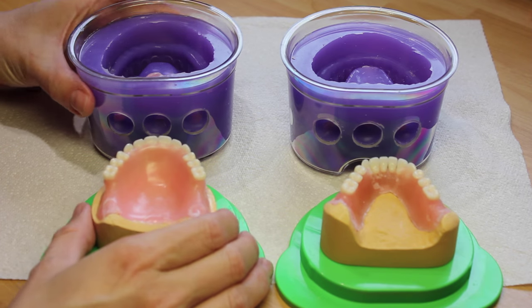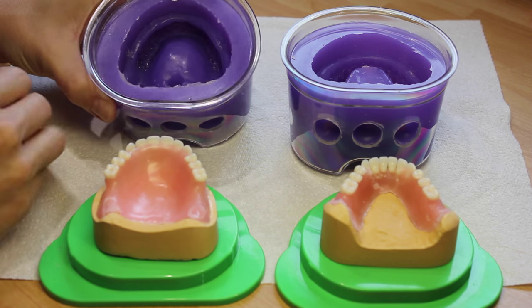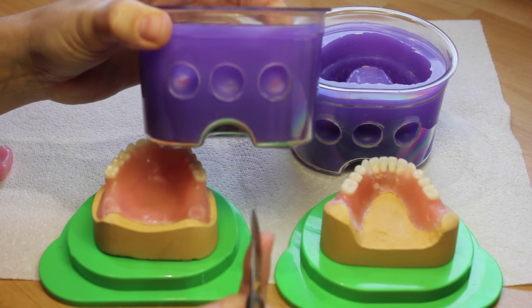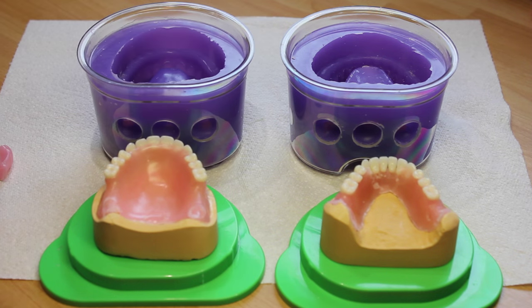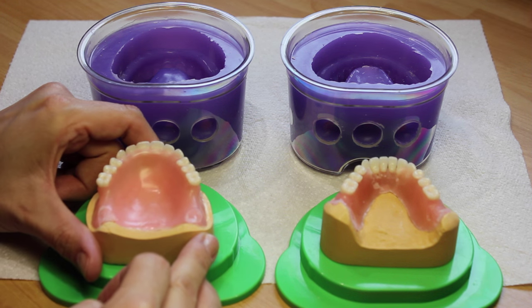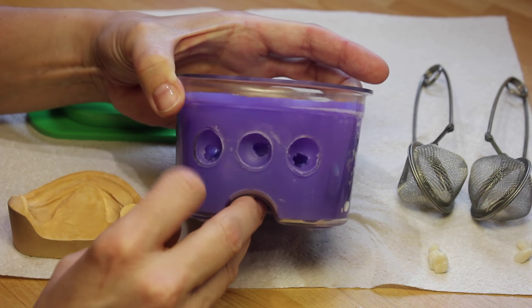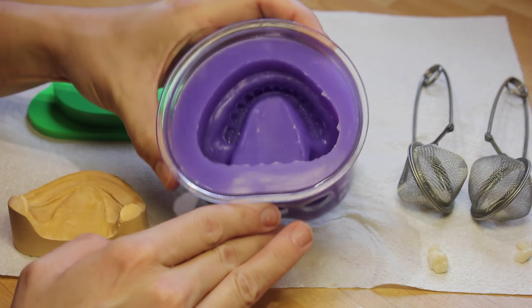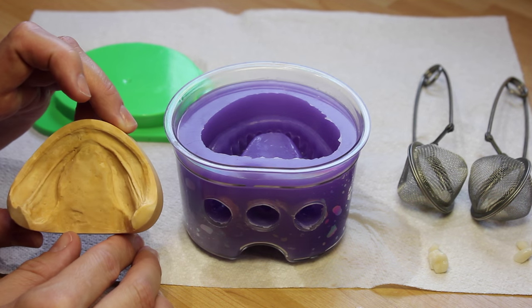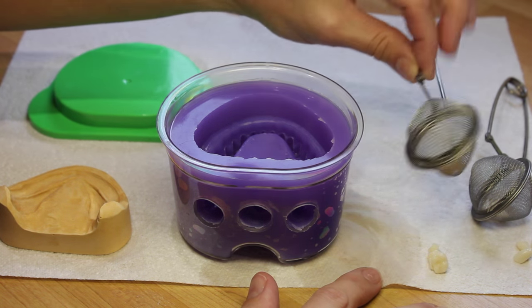Once you've removed the models from the silicone, clear out any of the sprues that have broken off. Open up any holes covered by silicone with scissors or a scalpel, and boil out the models, popping all the teeth off and keeping them in the right order. I tend to do a few teeth at a time to avoid mixing them up, using tea strainers.